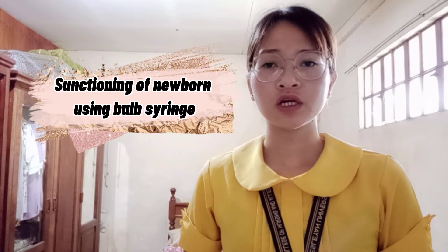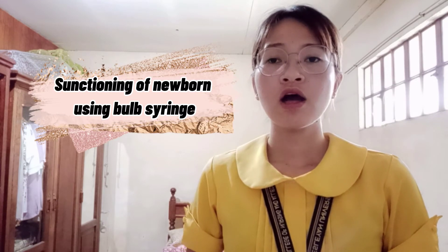Good afternoon, ma'am. My name is Miyama Siya Sochong and I'm going to perform suctioning in a newborn. The purpose of this procedure is to remove visible mucus, secretions, and vomitus from the newborn's mouth or nares.